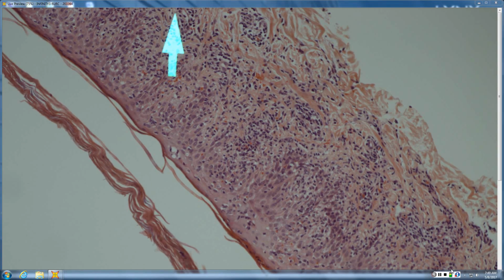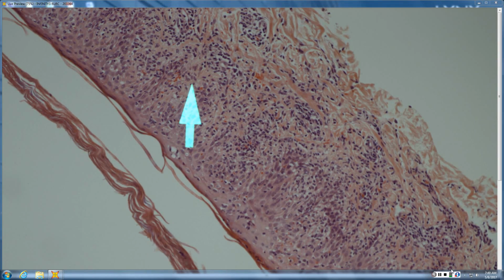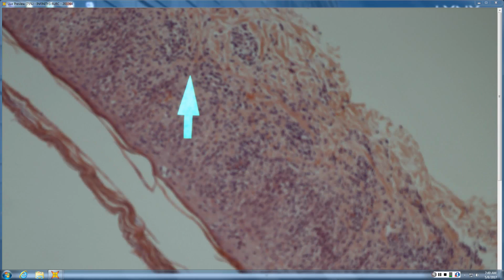This one has a lot of erythrocyte extravasation. That tends to go with which one? Pleva? Yeah, so it tends to go with pityriasis lichenoides. For MF, you might expect more papillodermal fibrosis, which is very characteristic. A lymph in every hole plus papillodermal fibrosis, you think MF. Lymph in every hole plus red cell extravasation, you think pityriasis lichenoides.